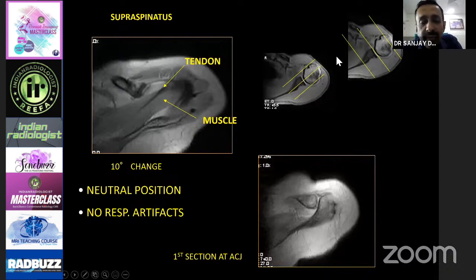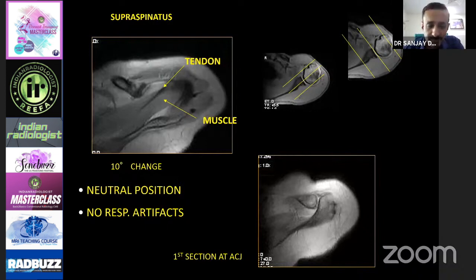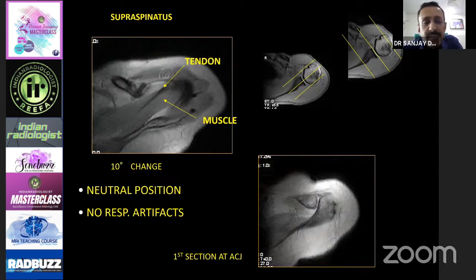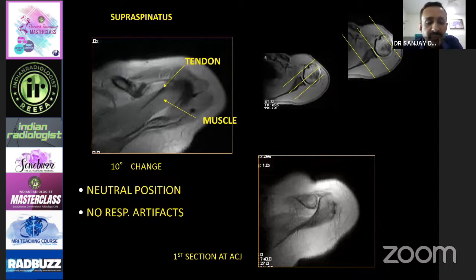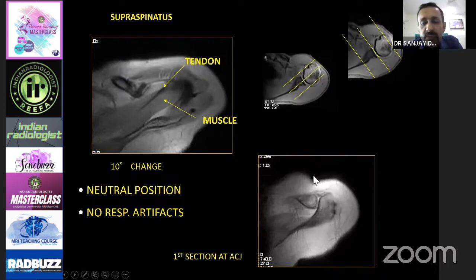The field of view has to be set so the glenohumeral joint is in the center, covering adequate portions of the rotator cuff muscle and just beyond the tendon insertions. A too-large FOV will result in lung parenchyma and breathing artifacts. The FOV should be around 15 to 16 centimeters. The hand has to be placed in neutral position with the thumb pointing upwards, and there should be an air gap between the arm and the chest to avoid transmission of breathing artifacts.